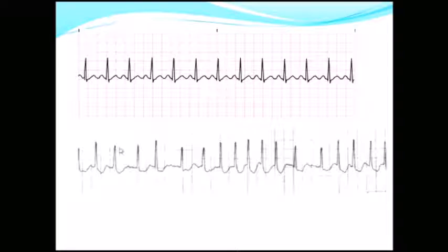Okay, so remember, the ECG graphs for about 10 seconds, yeah? So kind of a cheap way to do it is if you just count the number of R waves and then times it by 6, you'll have the number of R waves in a minute and therefore the heart rate in 1 minute, yeah? So this one, 1, 2, 3, 4, 5, 6, 7, 8, 9, 10, like 17-ish, yeah? So we can say 17 times 6 is 102. So this is a tachycardia.